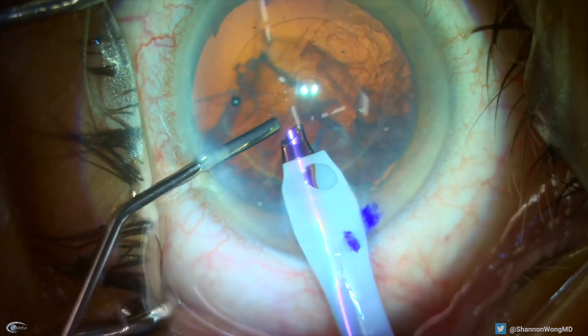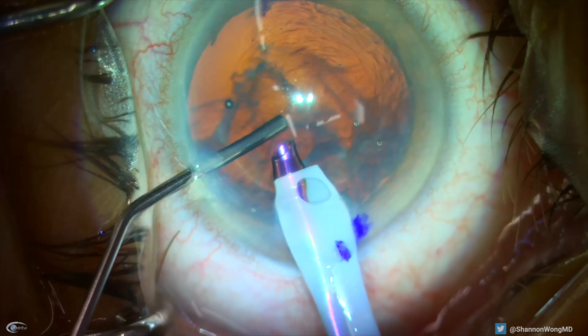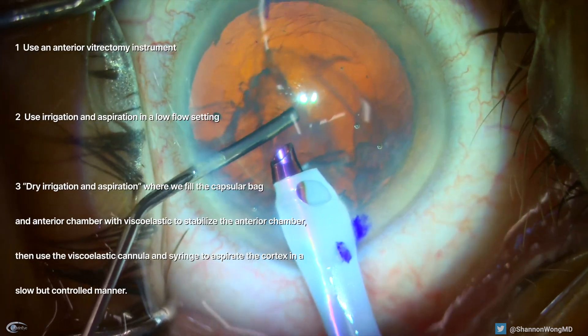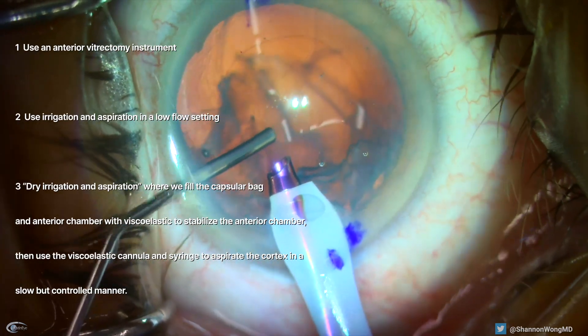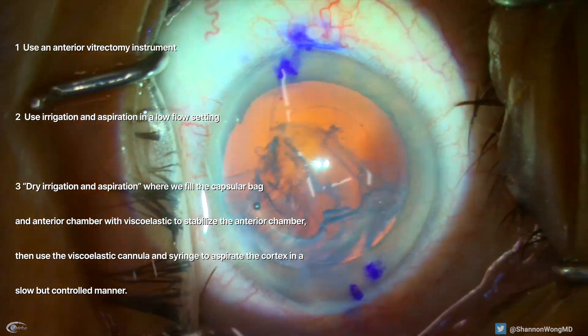Now we have several choices on how to remove the cortex. Number one, use an anterior vitrectomy instrument. Number two, use irrigation and aspiration in a low flow setting. Or number three, use dry irrigation and aspiration.